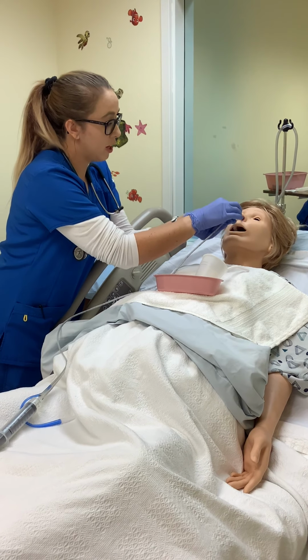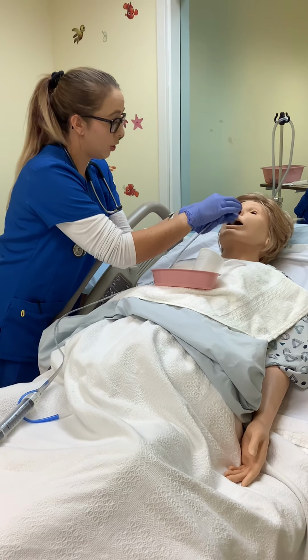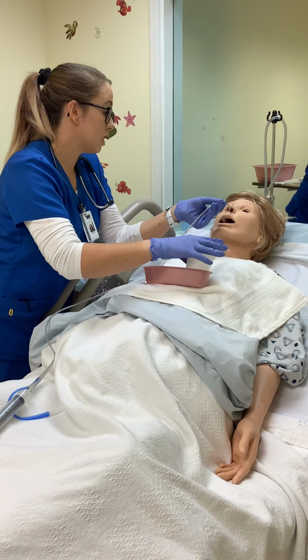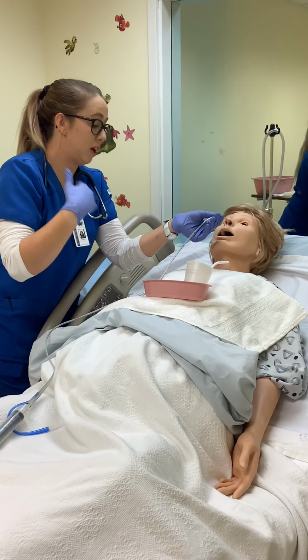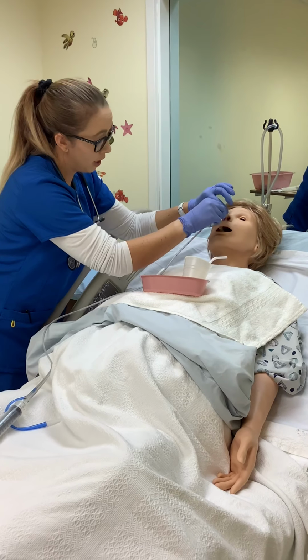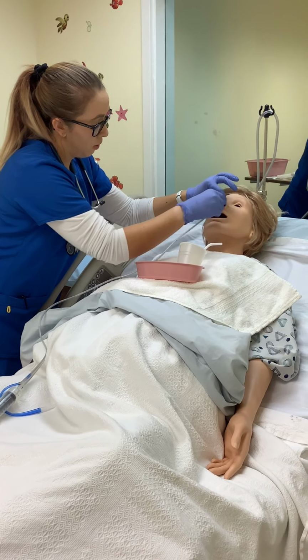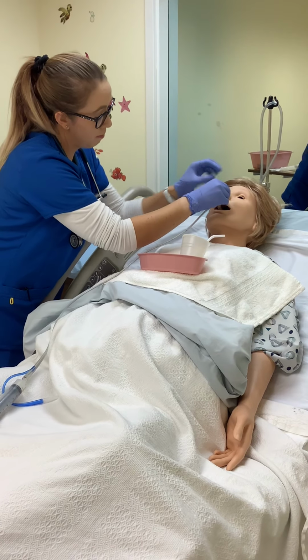Okay, Shirley, now I want you to go ahead and forward flex your head as well as taking your ice water, and when I say swallow, take a drink of it. This will help with the discomfort and the gag reflex, okay? So are you ready? 1, 2, 3, swallow, swallow, swallow. Perfect.